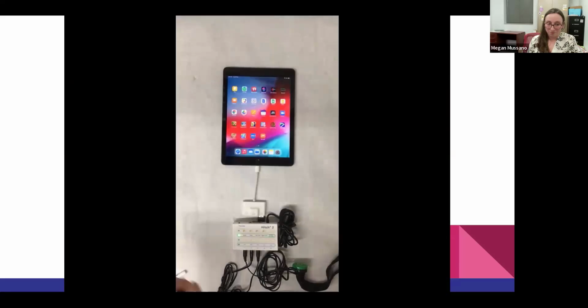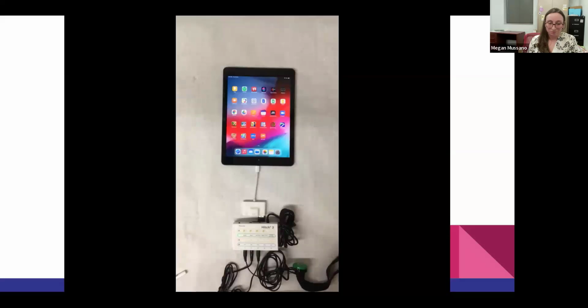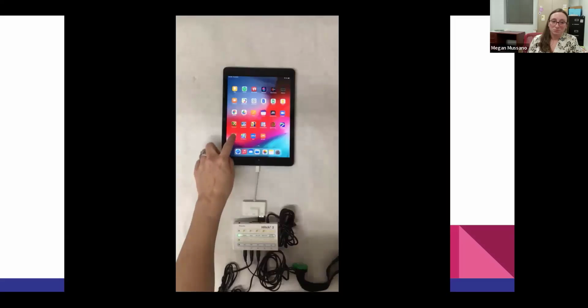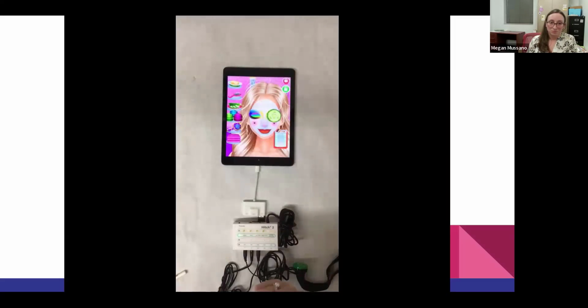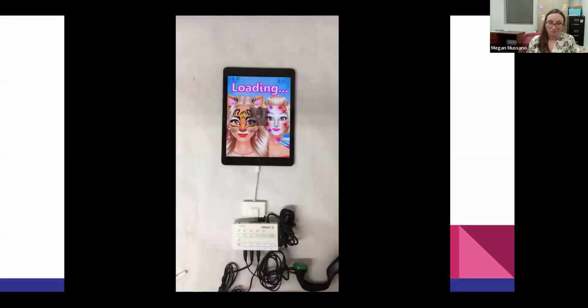Basically, that's what I have to emphasize. Go ahead and pick any app, whether it be Fruit Ninja for swiping that you would need to access, maybe a spin art app where you have to pick a color, paint, press the spinning to go, even something like this, Paint Party. This is a makeup based app that I just thought would be fun for one of our students if it's something of their interest. Determine first what the app requires to be successful.